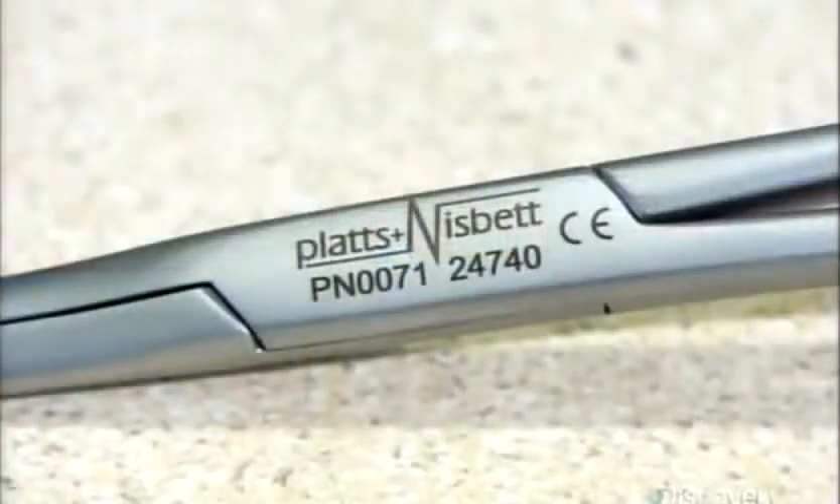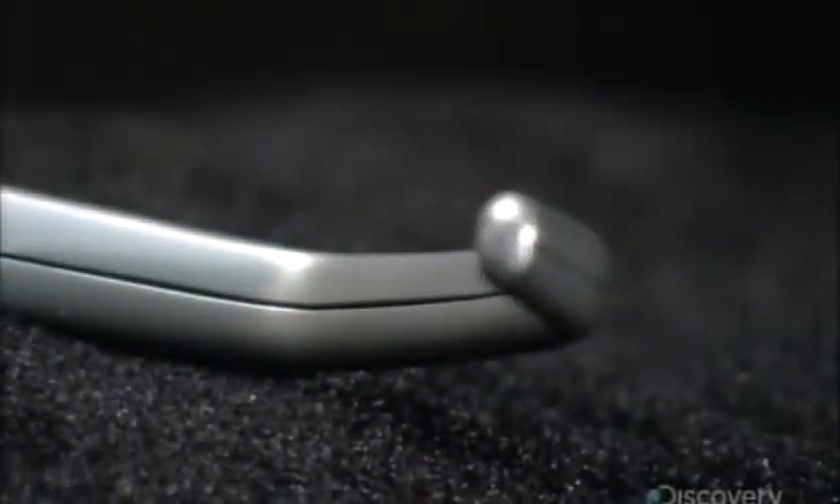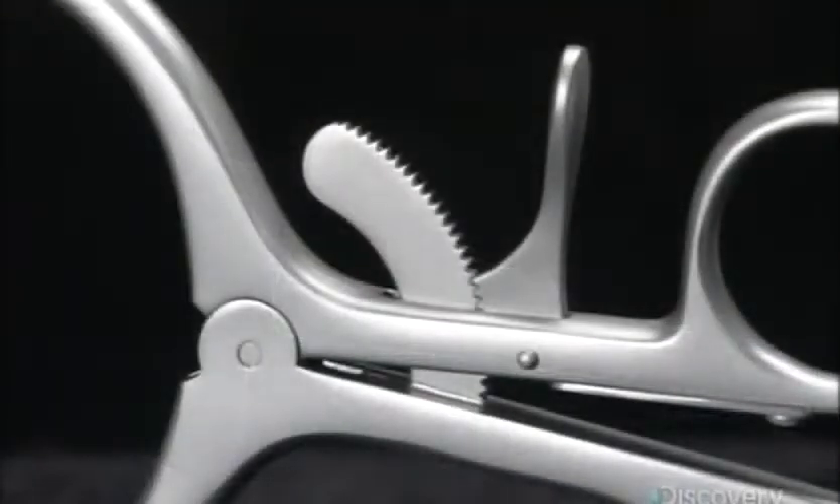He smooths the inside of the finger bows with a fine abrasive belt. After heat treatment to strengthen the metal, they blast it with fine glass particles to give it a satin finish. They laser etch the company name and identifying numbers onto the surgical clamp — the numbers will allow the tool to be traced back to a particular production run. And now it's ready to take its place on the front lines of healthcare.